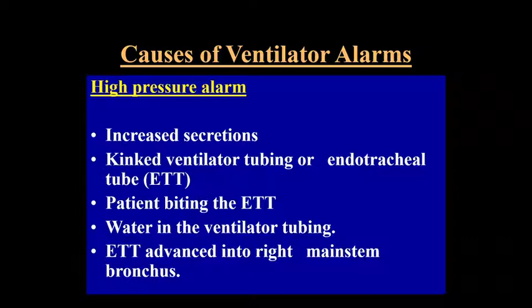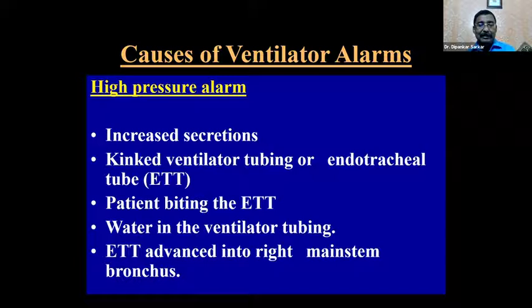High pressure alarm, activate the medical team. And by that time you check kinking, whether the patient is conscious and biting the ventilator tube, whether there's water in the tubing or whether there's any increased secretion. You just suction. But before that, you inform the treating team.